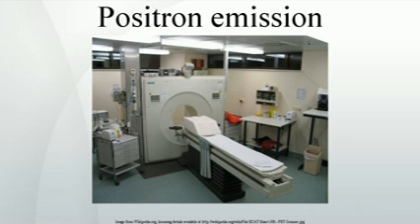Cardiology, atherosclerosis and vascular disease study. In clinical cardiology, FDG-PET can identify so-called hibernating myocardium, but its cost-effectiveness in this role versus SPECT is unclear. FDG-PET imaging of atherosclerosis to detect patients at risk of stroke is also feasible and can help test the efficacy of novel anti-atherosclerosis therapies.